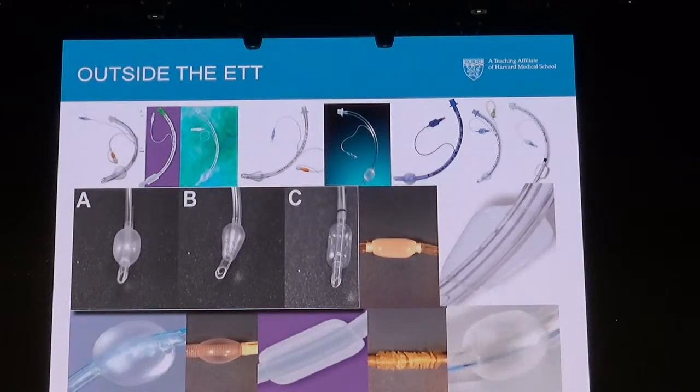But when we investigated and reported this data in laboratory studies, we didn't see any difference in terms of decrease in aspiration through these endotracheal tube cuffs. With all cuffs that we use in the ICU, there is always aspiration through the endotracheal tube cuff.